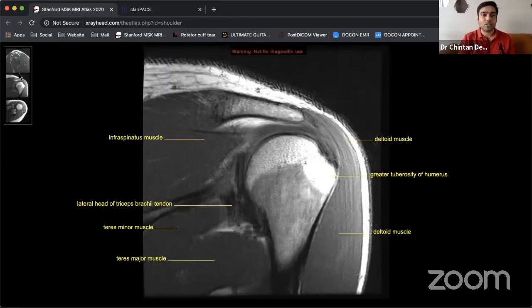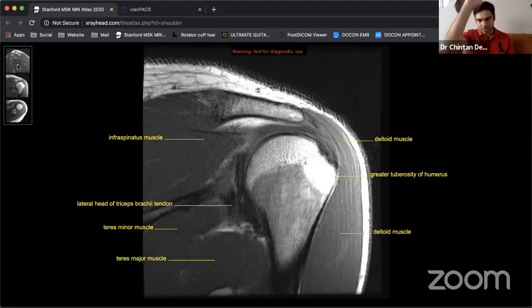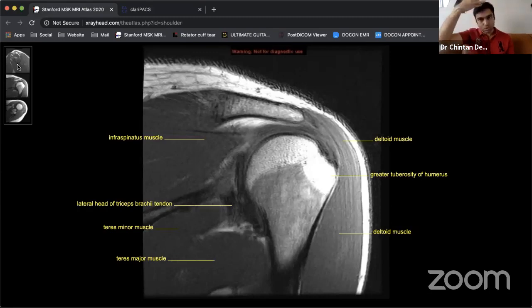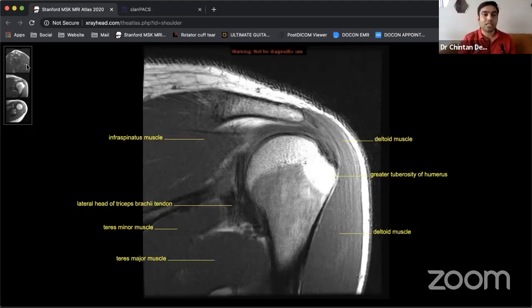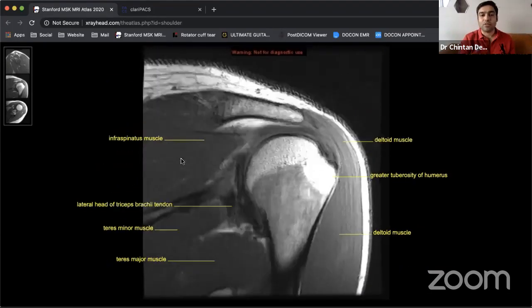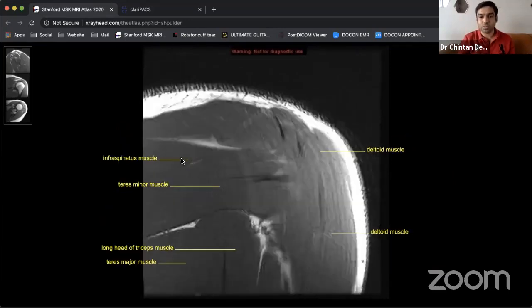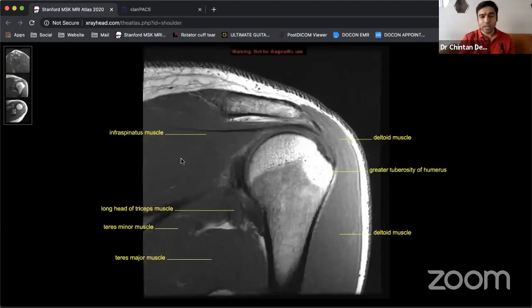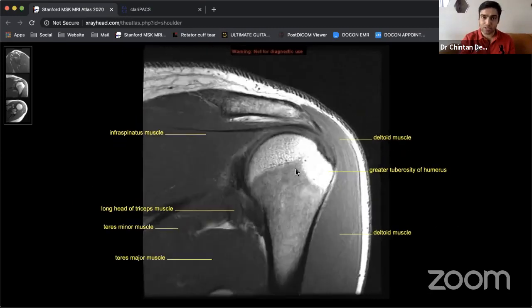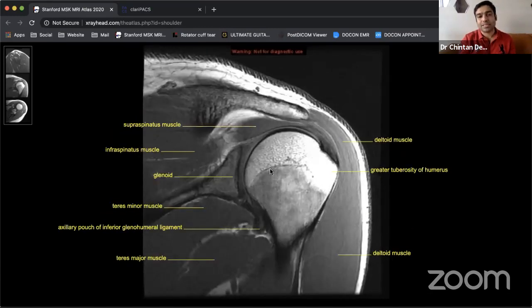The terminology for views comes from the sutures of the head: the sagittal suture runs straight, the coronal suture crosses perpendicular, and axial images take cuts perpendicular to the body. In the shoulder, coronal images are quite important — when you view the shoulder in the line of the supraspinatus, the coronal images are most useful for checking supraspinatus, infraspinatus, or rotator cuff injuries. They are also important to locate SLAP injuries.